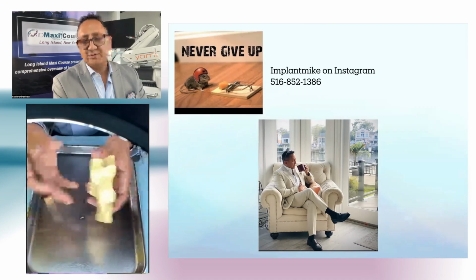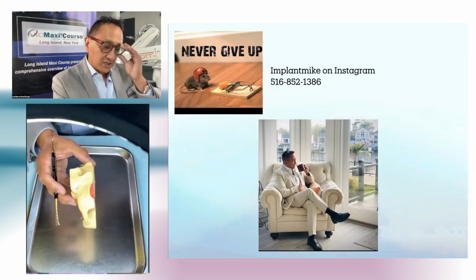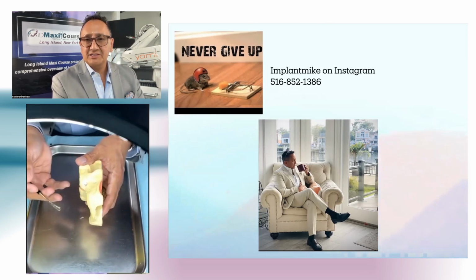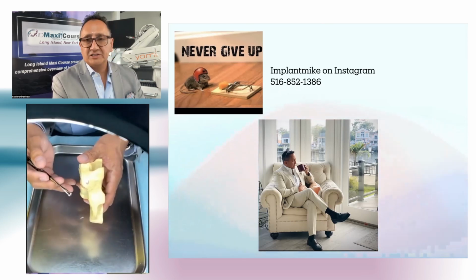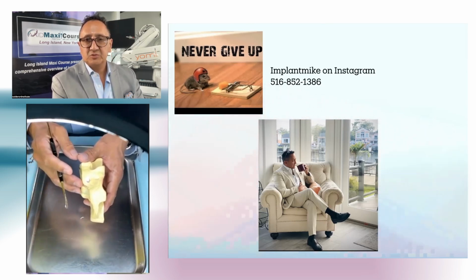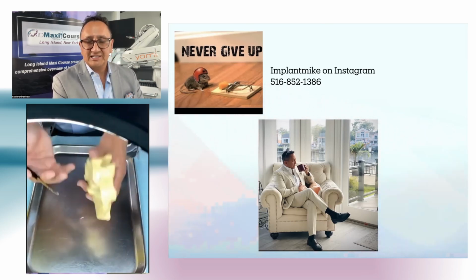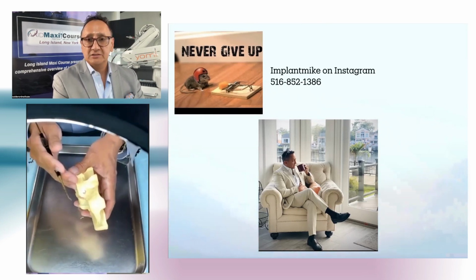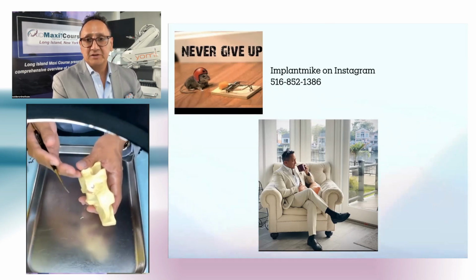And the people I learned from, somebody like Carl Misch, he always said that the bigger the window is, the better you can see, the better your surgery, because no matter what, it's going to heal. So don't try to be so conservative and make a small window, because it's going to be sloppy. You're going to tear the membrane. Something's going to happen in there. Let's just do it right. Look at it, because surgery is about visual. You've got to be able to see it.